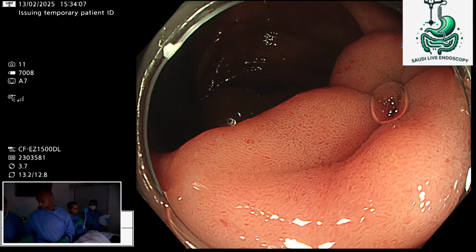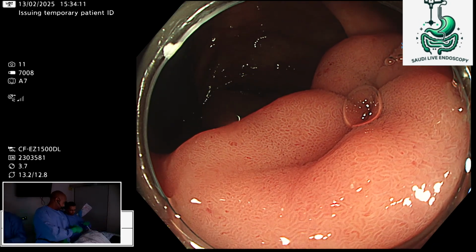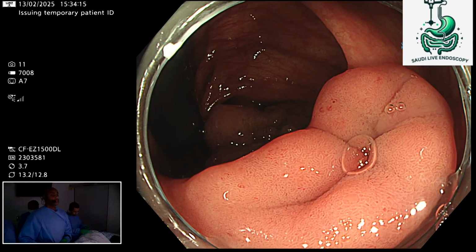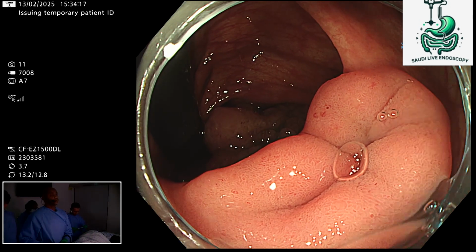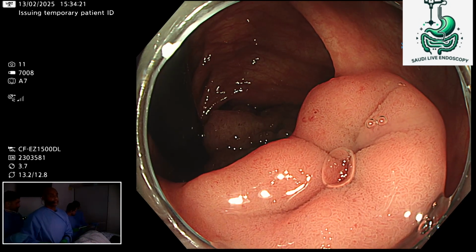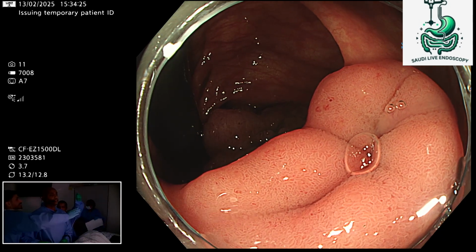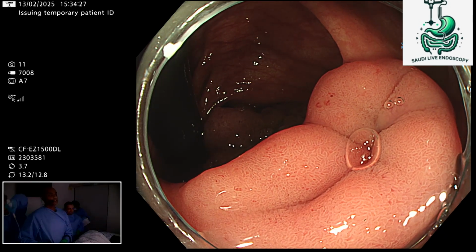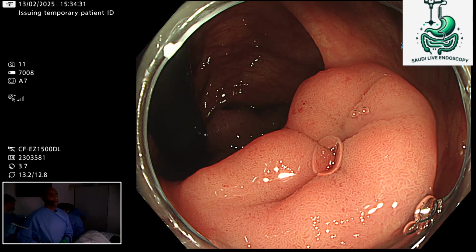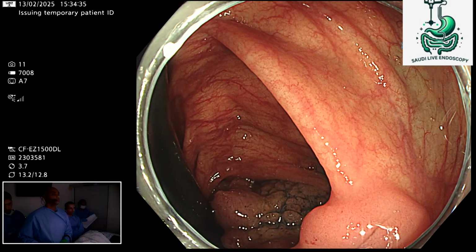And you can see Dr. Ammar is also using a distal attachment cap from Olympus, and that's improving the axis and visualization as well. Especially because when we looked at the images initially, we thought it may have been involving the IC valve. I think this is definitely a situation where you want to have a cap to help you with pushing away the folds and seeing the proximal aspect of the lesion and being able to maintain your view while you're doing that. Okay. So open completely here for me.